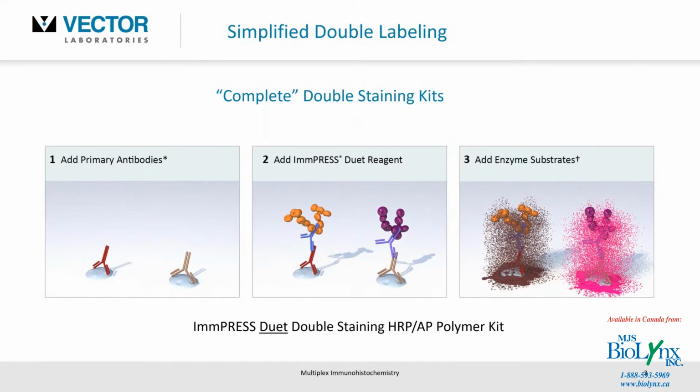The example I've got here is an abbreviated workflow of a double label methodology, whereby we have one primary antibody that might be a mouse primary antibody binding to its target antigen. Here's a rabbit primary antibody binding to its target antigen. Then you detect them with their respective secondary antibody detection reagent. For example, this would be an anti-mouse HRP, or peroxidase-based conjugate, and here's your anti-rabbit with alkaline phosphatase. Then you develop those given signals independently with the appropriate contrasting enzyme substrates. These are part of what we call our ImmPRESS Duet double staining kits.